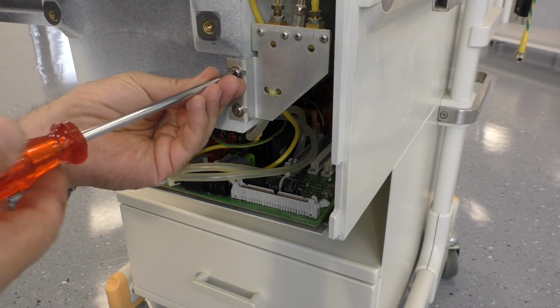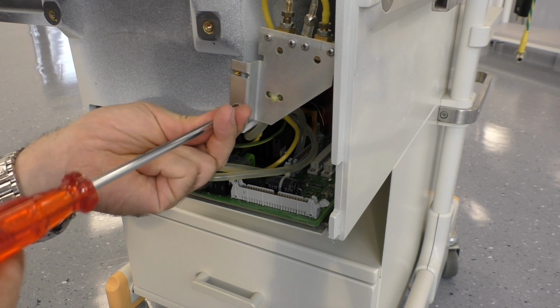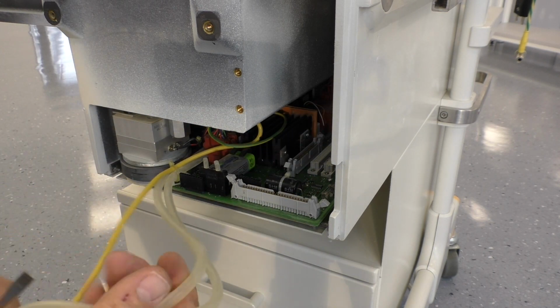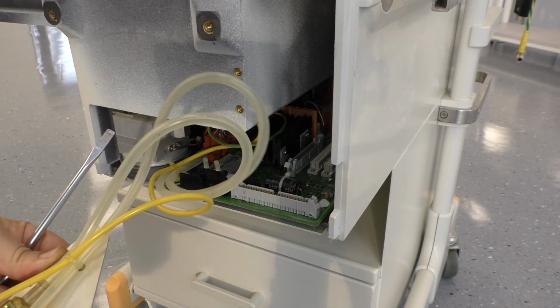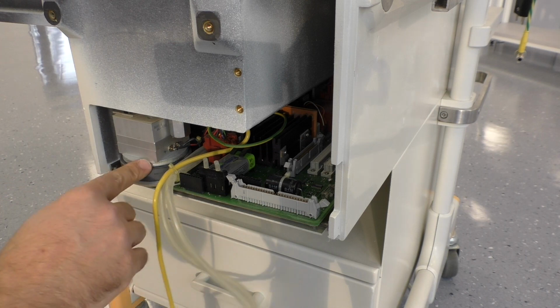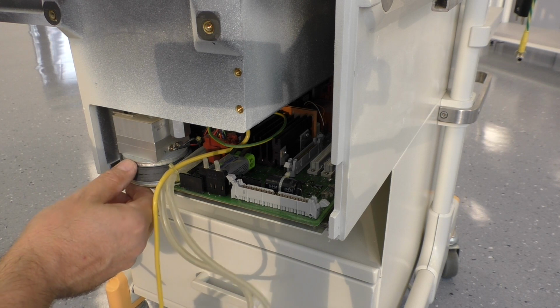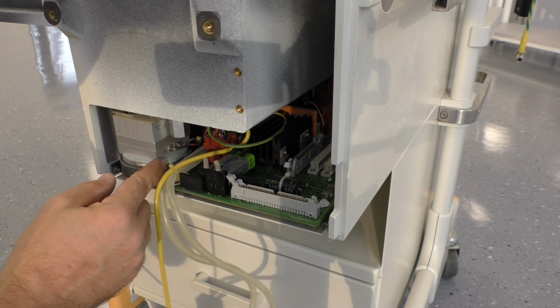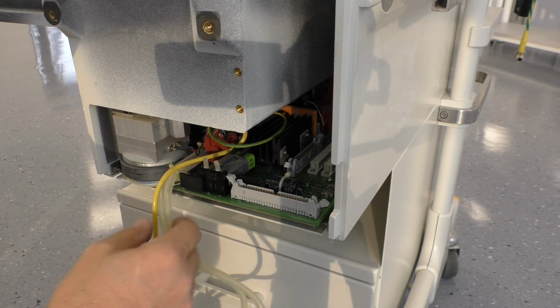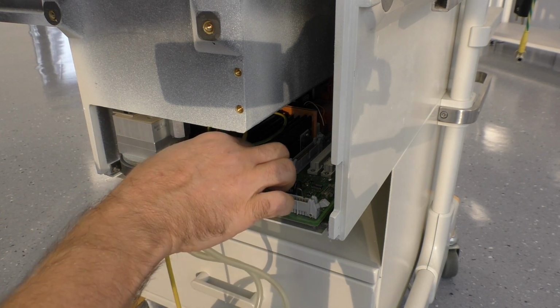because most parts here work with air, pneumatically. Okay. So we expect a lot of hoses and lines and pressure sensors. This one is interesting. It looks like a magnet from a speaker, and on top there is a block of aluminium with two wires, red and blue. Maybe it's some sort of shaker, maybe it's some sort of loudspeaker, I don't know.